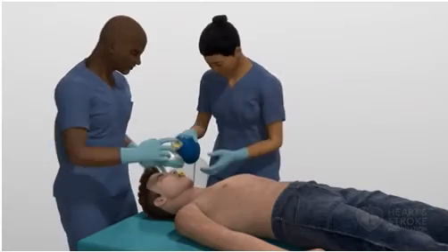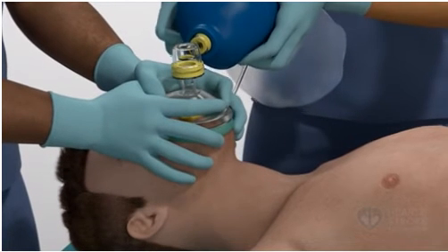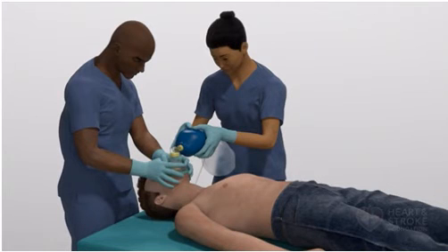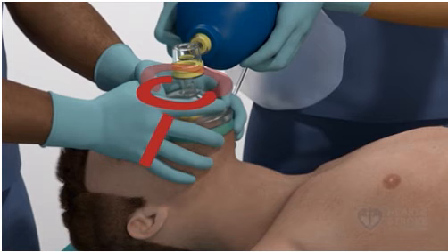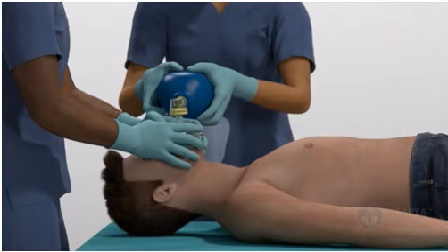The most effective way to deliver bag mask ventilation is to use the two-person technique. The first provider focuses on keeping the airway open and securing the mask, while the second provider delivers ventilation with the bag. The first provider uses both hands to seal the mask to the patient's face and lift the jaw. The thumbs and index fingers of both hands each form a C, ensuring a good mask seal against the face, with the 3 remaining fingers of each hand forming the E, lifting both sides of the jaw into the mask. The second provider squeezes the bag, enough to cause visible chest rise.